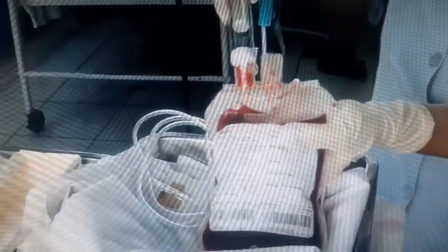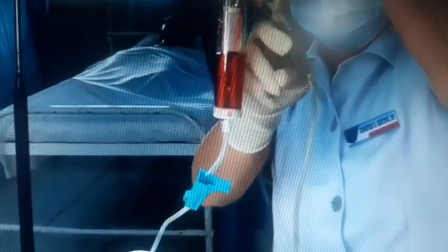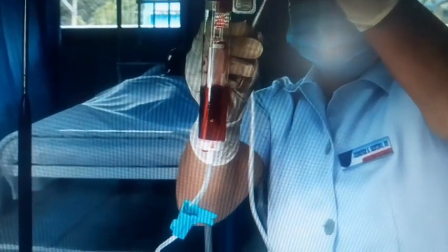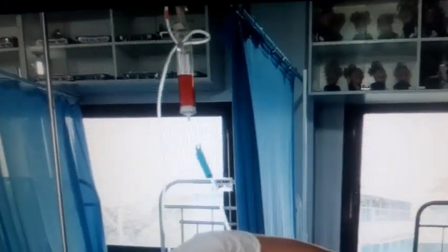Close the roller clamp of the IV fluid of plain NSS inside the tubing and open the regulator of the blood inside the tubing, and transfuse the blood via the injection port and regulate at 10 to 15 gtts initially for 15 minutes, and then the prescribed rate. Most reactions occur within the first 15 minutes. Observe the client closely for the first 15 minutes. Take note of adverse reactions such as chilling, nausea, vomiting, skin rash, or tachycardia.